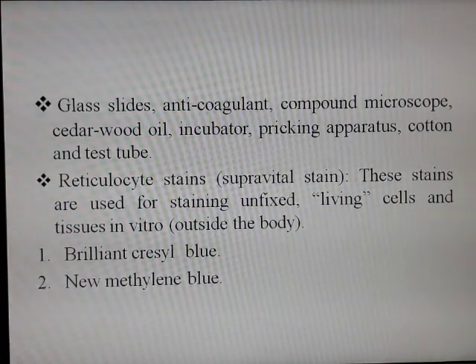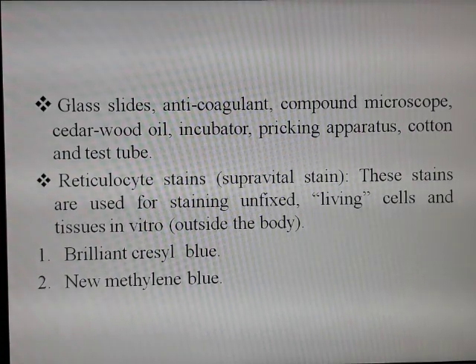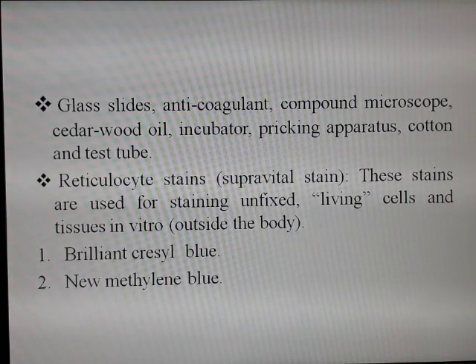We need an anticoagulant such as EDTA, ethylene diamine tetraacetic acid, a compound light microscope, cedarwood oil, incubator, pricking apparatus such as needles or a sterile lancet, cotton, test tube. And also we need spirit or antiseptic solutions to apply on the finger after pricking.